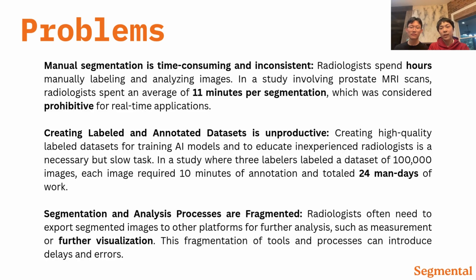Beyond individual analysis, creating the high quality labeled datasets needed to train new AI models is a monumental task. One study showed that annotating a large dataset required over 24 man days of work. Finally, the entire process is fragmented. Clinicians often have to use one tool for segmentation and another for analysis, introducing delays and potential errors. These challenges slow down patient care, hinder research, and create a need for a unified, efficient solution.